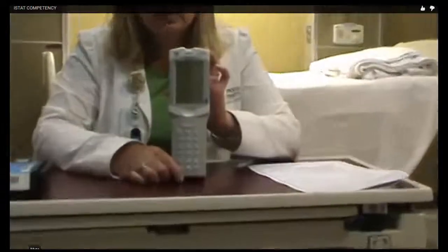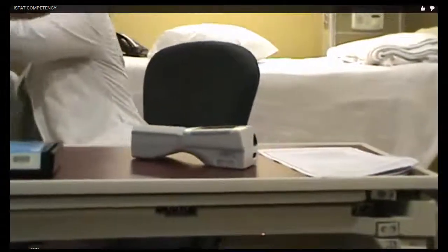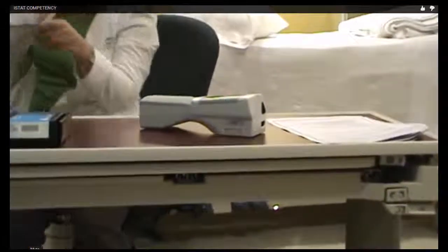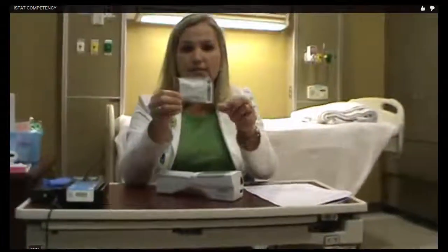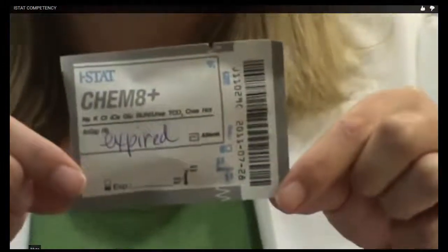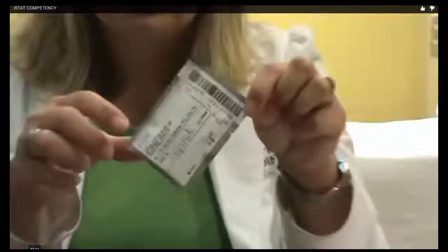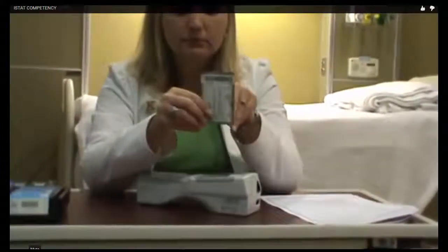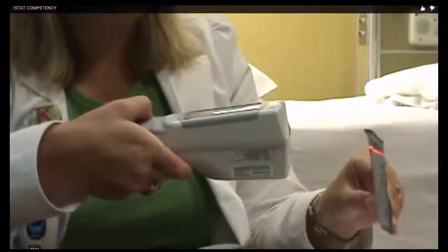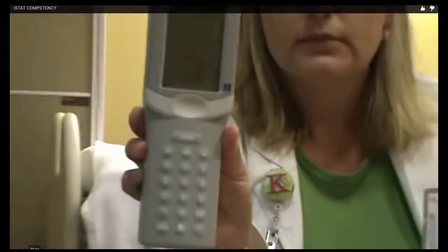Now it's saying to enter or scan the cartridge ID number. Here's what a cartridge looks like. This is actually an expired one, but we're going to use it for demonstration purposes. So you would pull this out of the refrigerator, let it sit for 5 minutes at room temp before you would actually perform your test. The barcode is here on the top. So all you do is line it up, and you can hear it with a little audible beep, and it's telling me to insert the cartridge. Okay, so we're ready.